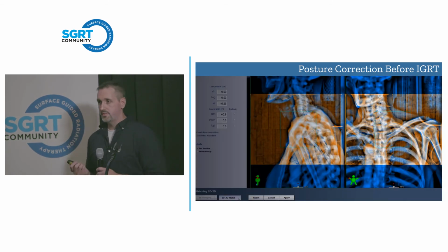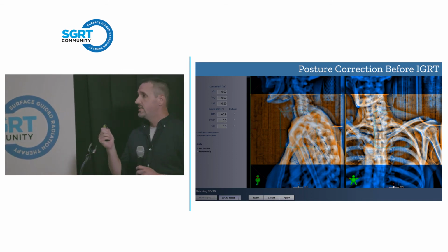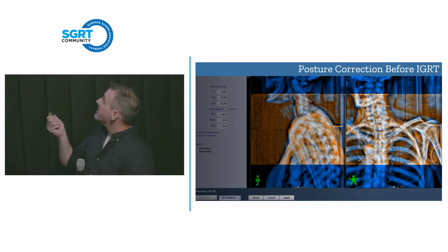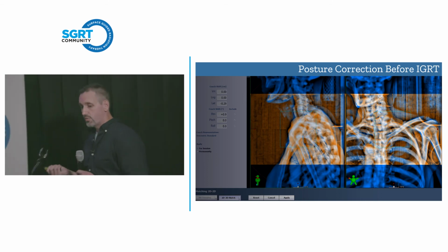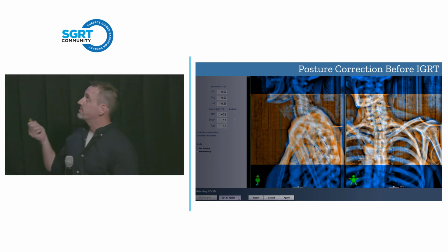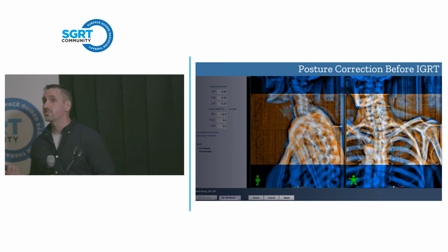You can see that a 3 millimeter shift is required, but if you look at the alignment on the ipsilateral side, as I stretch back here, you can see the clavicle, the chest wall, the neck, and the chin positions are all in place. We're requiring only a 3 millimeter shift. You can also see the frozen contralateral shoulder is slightly out of alignment, but we didn't use VMAT arcs to travel onto that side of the body, so we weren't concerned about that.